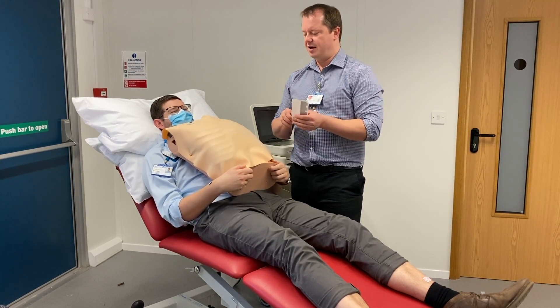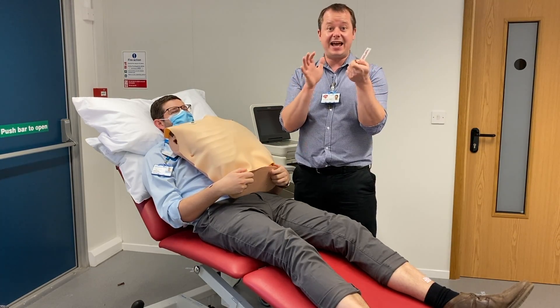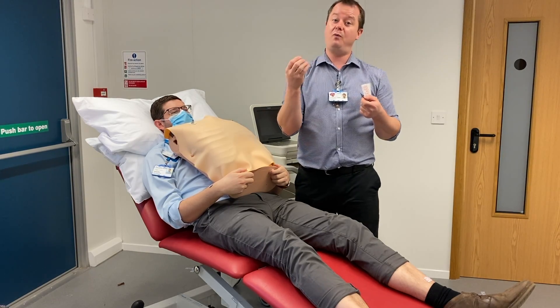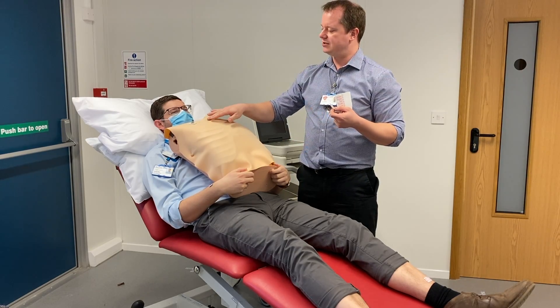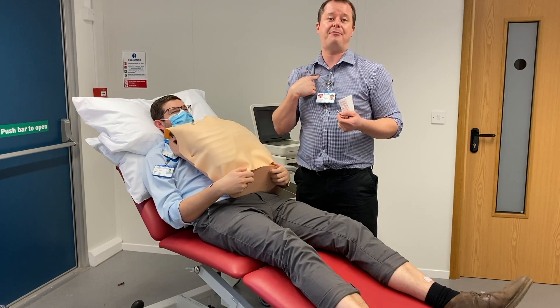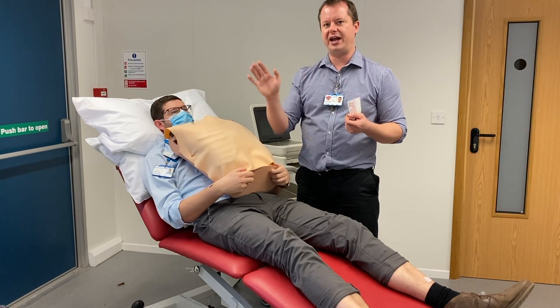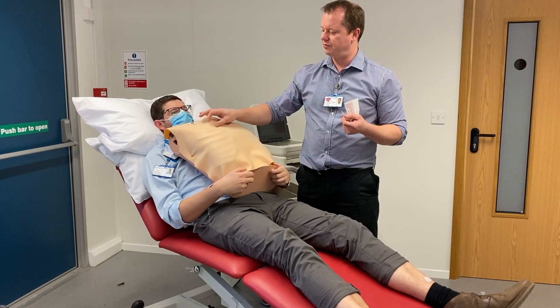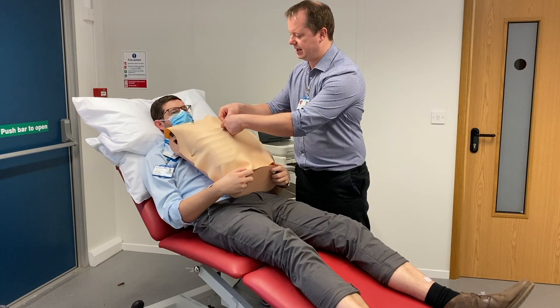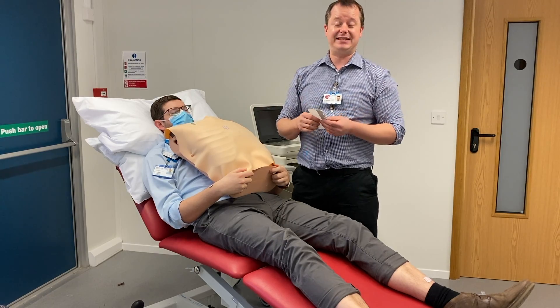We need to find the correct place for our first chest tab. There are six tabs to put onto the chest. The first tab we're going to put on is what we call V1, and we need to find that place on the chest. We want to put it in the fourth intercostal space - the fourth gap between the ribs - and we need to put it half on the sternum and half off the sternum on the right hand side. So we count down: one, two, three, four.